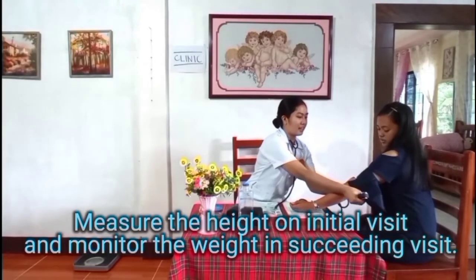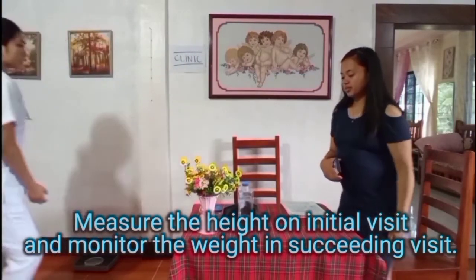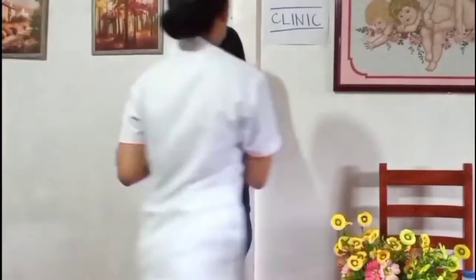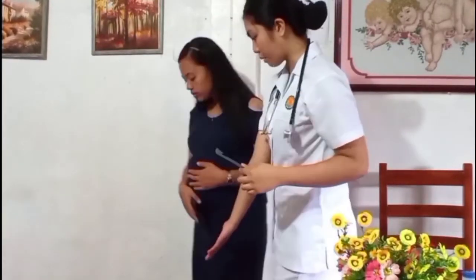Measure the height on the initial visit and monitor the weight in succeeding visits of each prenatal examination. A gain or decrease in weight will affect pregnancy.